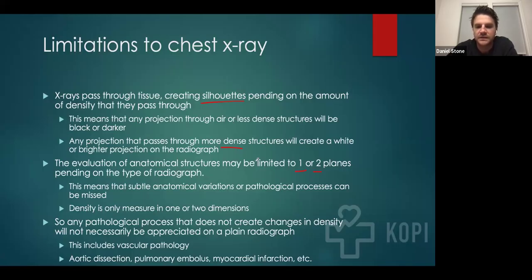That's why it's really important to get a lateral radiograph, because if you're skilled, you can tell a little bit more of the dimension of the chest. A lateral radiograph might be able to help you discern densities or infiltrates that might only be perceived otherwise in one plane.